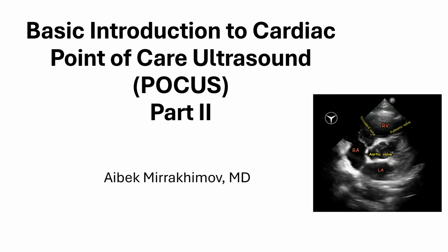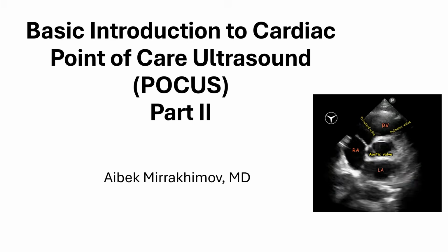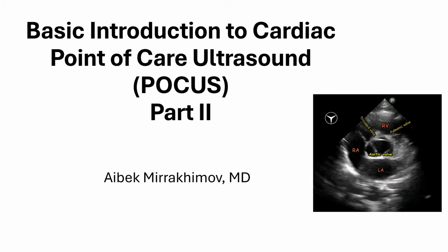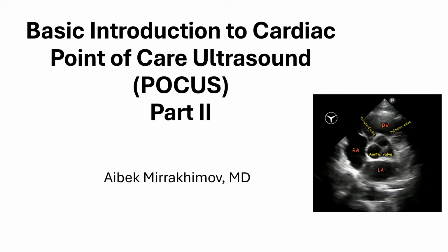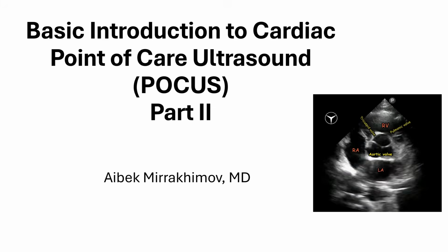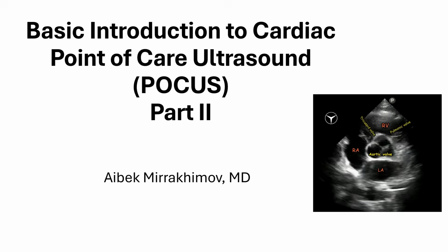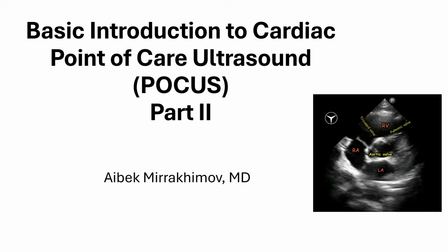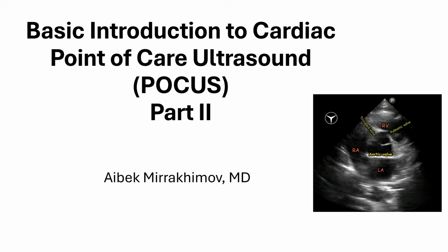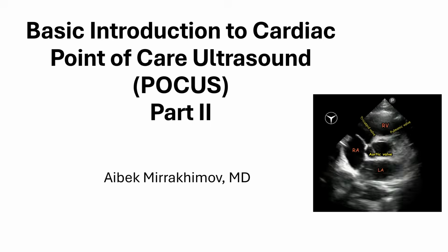I'm one of the cardiac anesthesiologists at the University of Kentucky, where I also serve as a director of point of care ultrasound within the Department of Anesthesiology. Today we do a part 2 lecture of a basic introduction to cardiac point of care ultrasound. This is a lecture for you if you want to expand your skills, and today we'll specifically discuss some advanced views with TTE and cardiac point of care ultrasound.